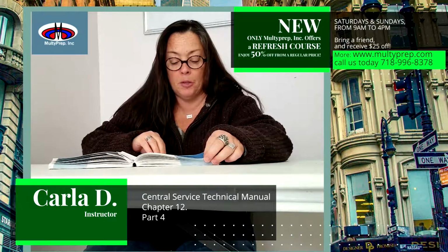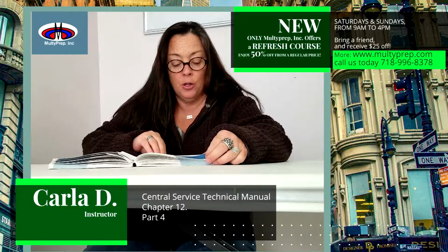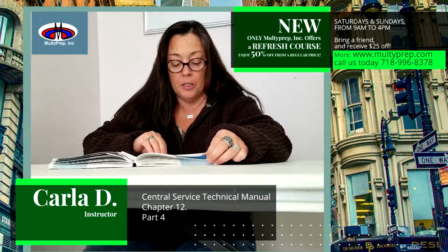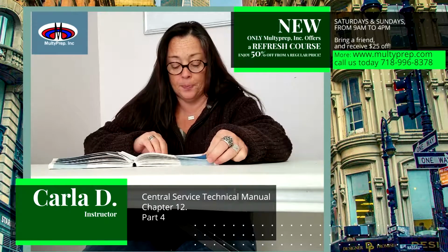Stress compromises the package's barriers and will likely rupture the side seams of the package during harsh air removal and heat up phases of the steam sterilization process, or the high vacuum phase of a hydrogen peroxide sterilization process. Items placed in packages that are too small can also rupture the seams during normal handling and transportation.